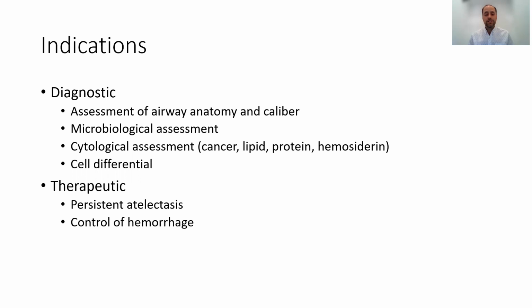It allows for a cytological assessment to look for cancer cells, lipids within the macrophages, protein or hemosiderin within the macrophages. It also allows an assessment of the cell differential if you're looking for lymphocytes in the case of hypersensitivity pneumonitis, or eosinophils in a patient with asthma or another condition.